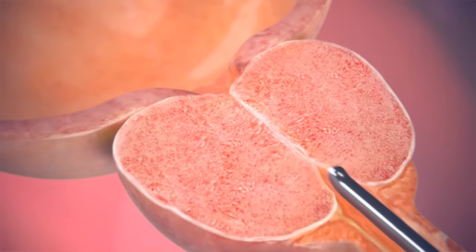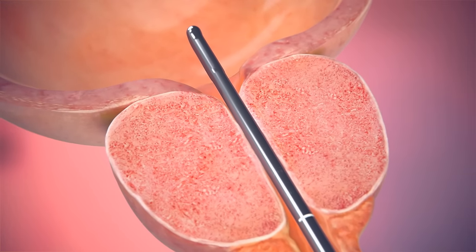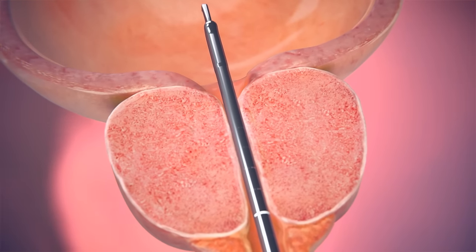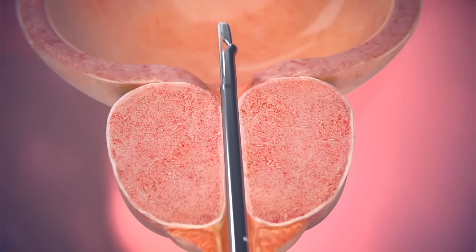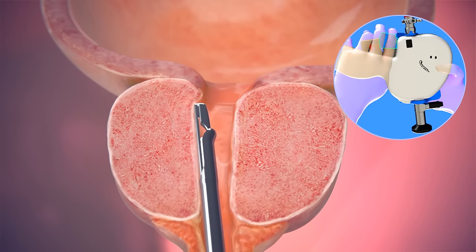The Urolift system procedure begins by inserting an implant delivery device into the urethra. An attached endoscope provides visibility to the obstructive prostate. On reaching the area blocked by the enlarged prostate, the obstructive prostate tissue is moved aside.